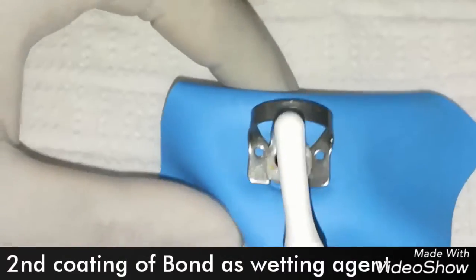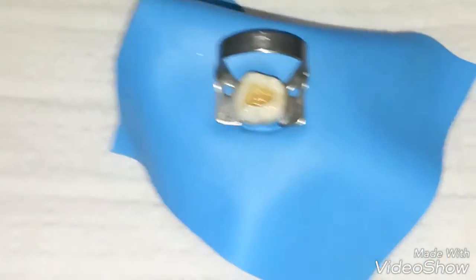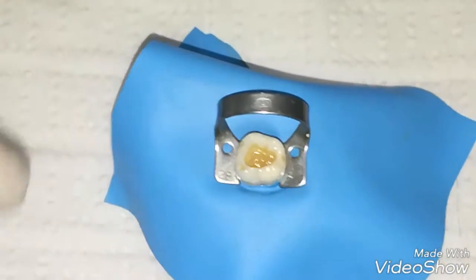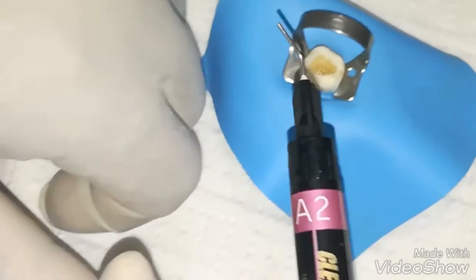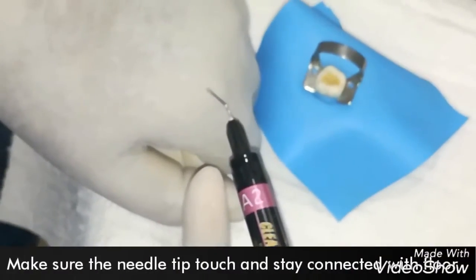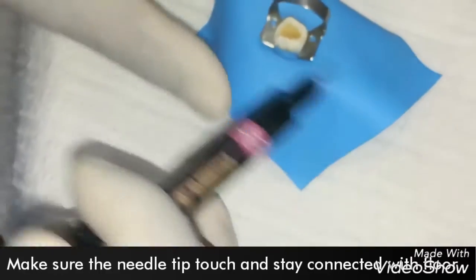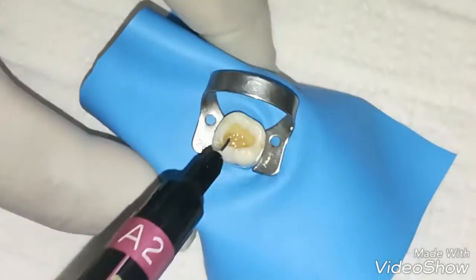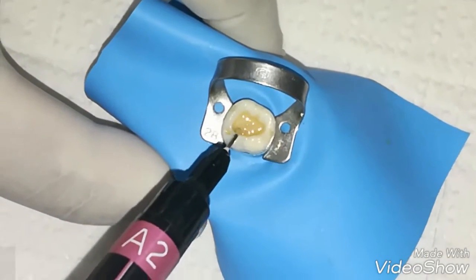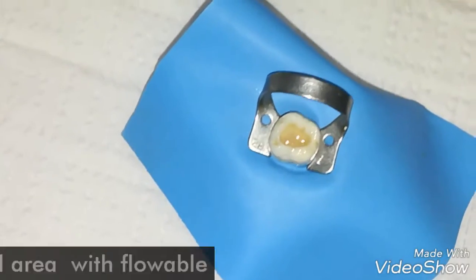Now we are going to apply a second coating of bonding which acts as a wetting agent. It will help the flowable composite to distribute perfectly to each and every part of the dentin and enamel. Before applying the flowable composite, we push a little bit of composite from the syringe to remove any air bubbles. Now we are going to put flowable composite on the floor of the dentin perfectly. More or less, it is 10 to 20% flowable.